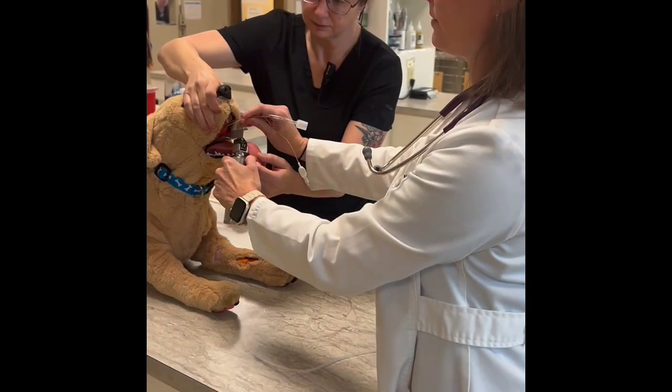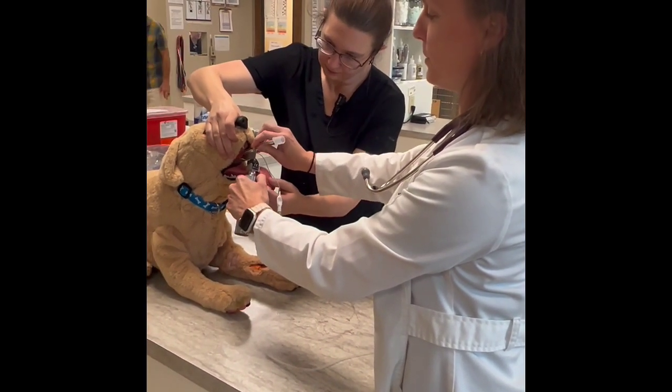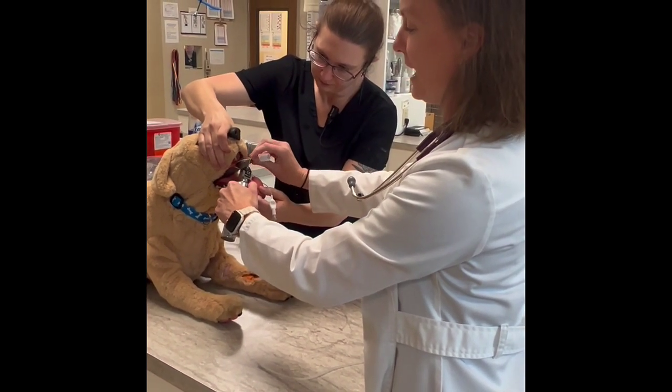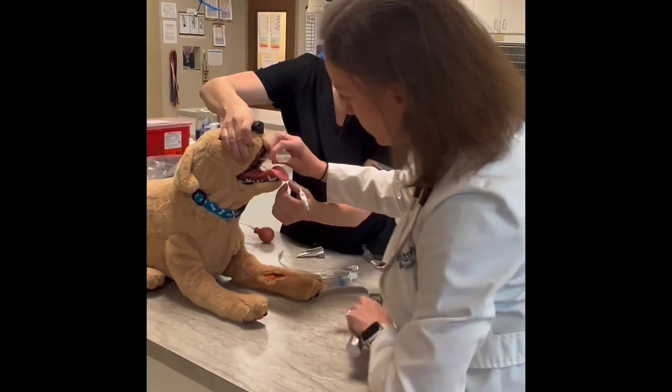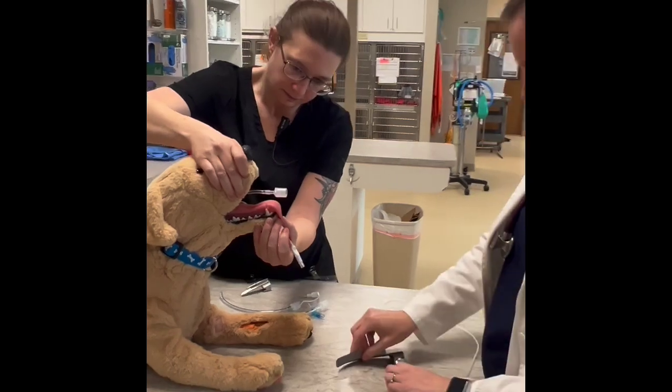Then you're going to very gently slide your tube directly in. This dog has a small opening so there's a little more friction than you actually should have, but gently slide it in. We're going to make sure that our 17 is lined up with the canine — and it is — looks good.